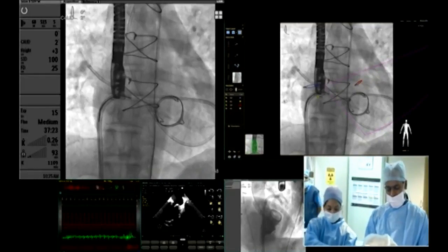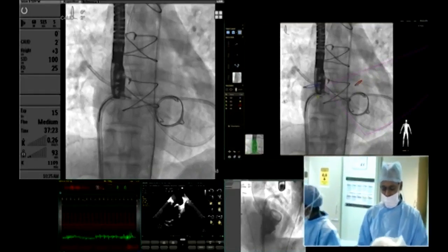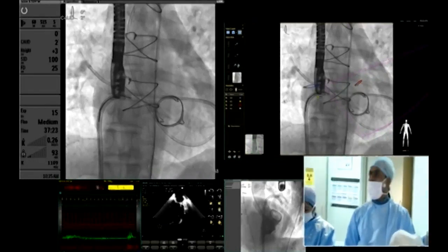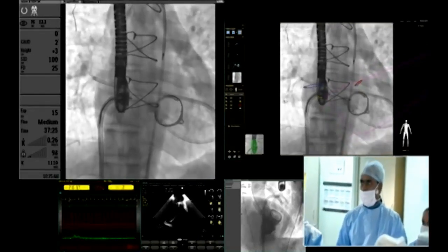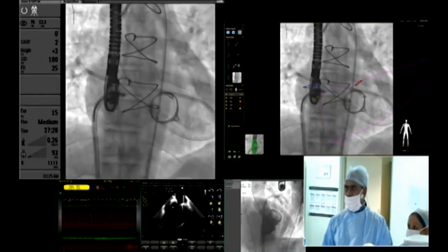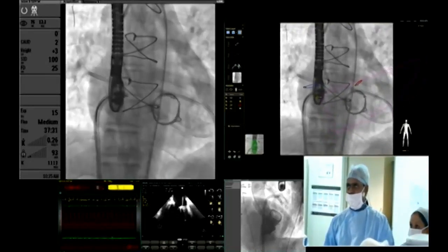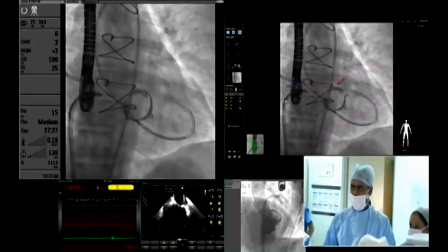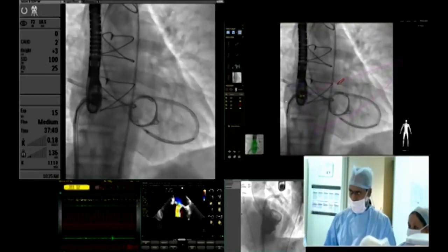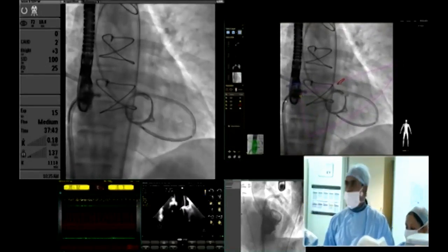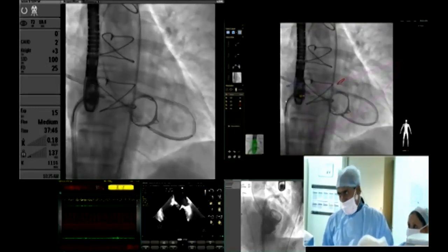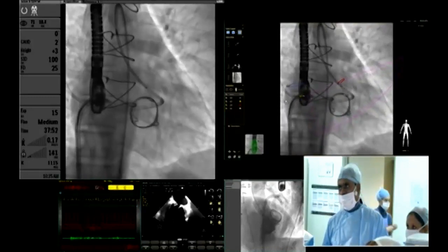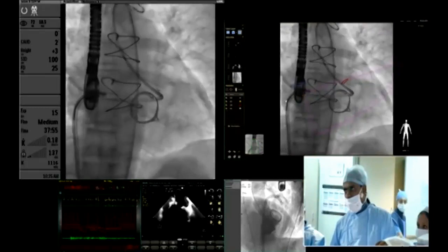Now what we have is a vascular plug going in retrograde. Echo becomes bigger now. When advancing the AVP2, since it is going through the bends, it gets into a little resistance in all the bend areas. There appears to be some resistance at the same spot — there is some kinking already. Now you are through — I have crossed that bend.